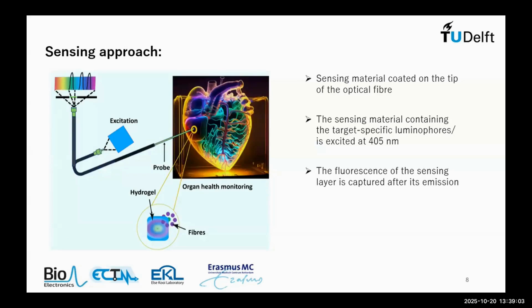The pH measurements, we started with a hydrogel. This was a heart surgeon in Utrecht, actually, who was interested in measuring pH. That's a very good indicator of deterioration of the organ during open heart surgery. So when they disconnect the heart, they have to make sure that the heart stays healthy until it is then reconnected. So these were the two starting points here.